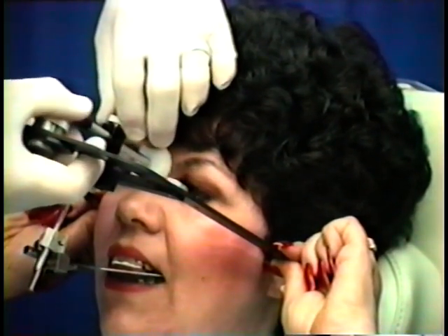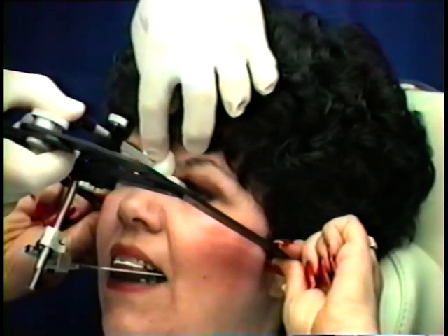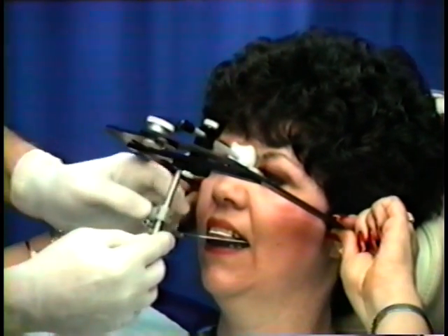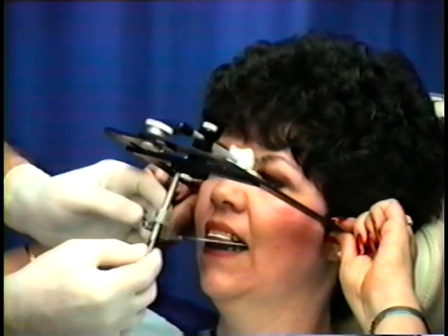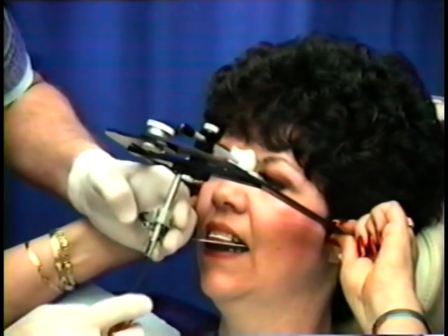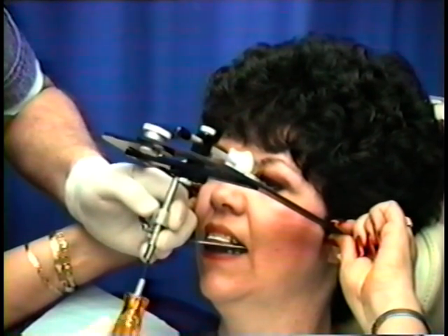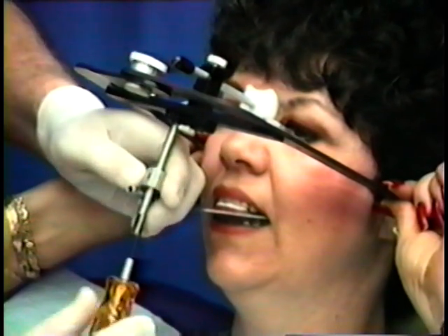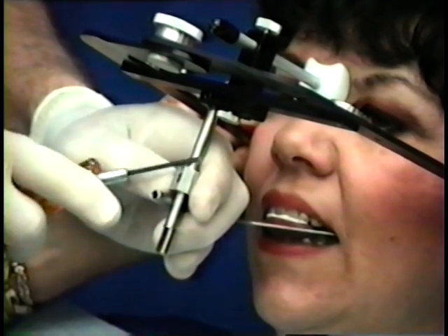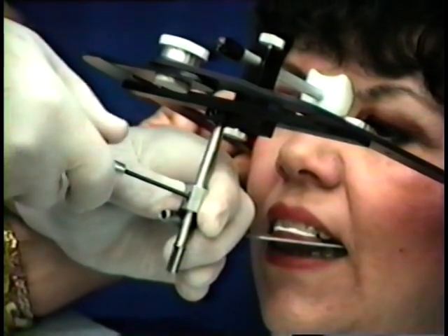The next step is to lock the large screw at the front of the face bow. Then loosen the screw that locks the nasion relator, and push back on this end of the stem slightly against the nasion so it is firm, then lock this screw. Make sure the toggles are loose — we don't want any binding in the toggles. The vertical height of the face bow has now been adjusted to the nasion. Grasp the toggles very tightly to offset the torque while tightening the vertical screw on the double toggle very firmly, then tighten the single toggle.